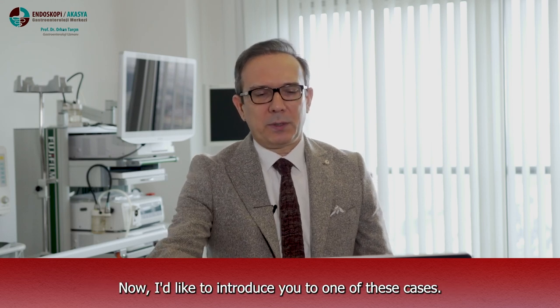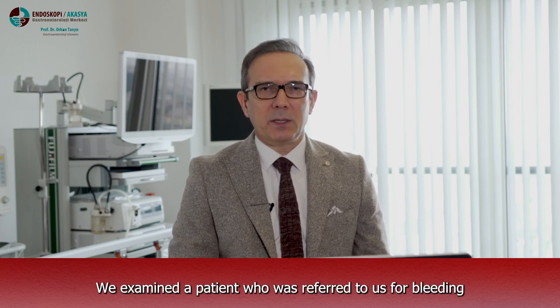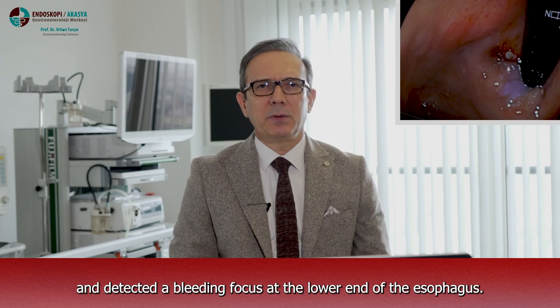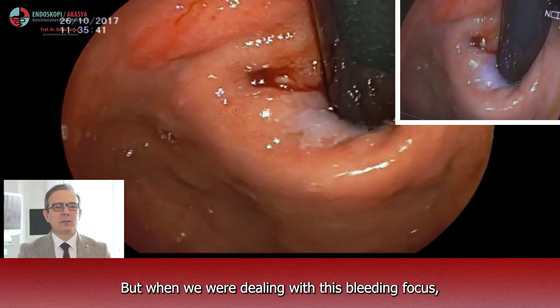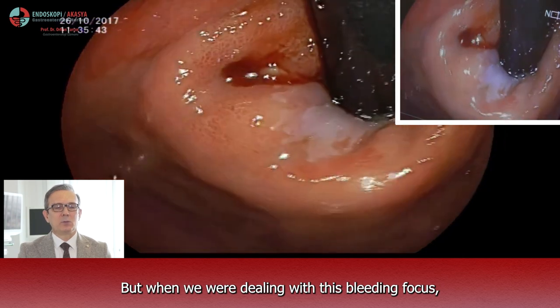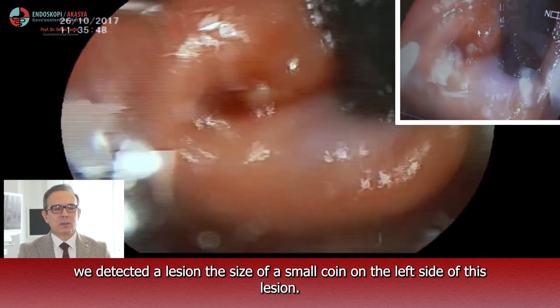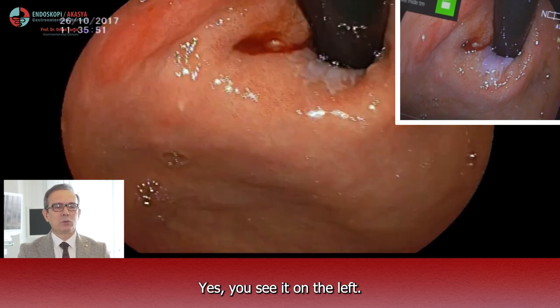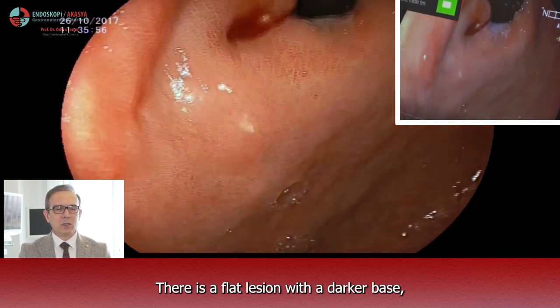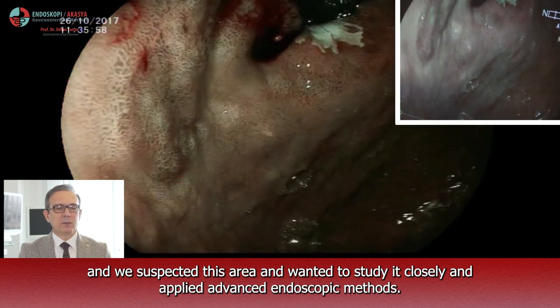Now I'd like to introduce you to one of these cases. We examined a patient who was referred to us for bleeding and detected a bleeding focus at the lower end of the esophagus. But when we were dealing with this bleeding focus, we detected a lesion the size of a small coin on the left side. It is going to be on this video now. You see it on the left — there is a flat lesion with a darker base, and we suspected this area and wanted to study it closely and apply advanced endoscopic methods.